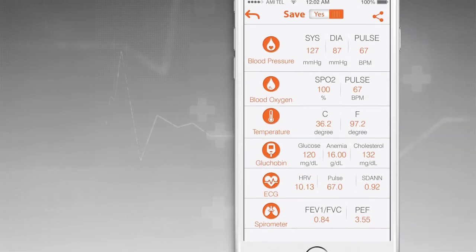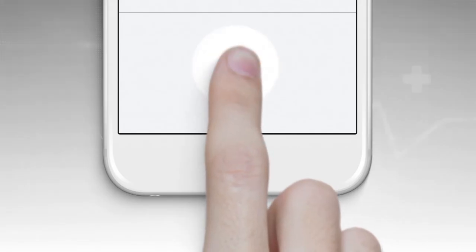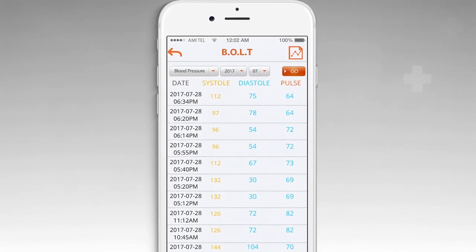After you complete the test, you can check your health status in detail and monitor your health history in the trends section.